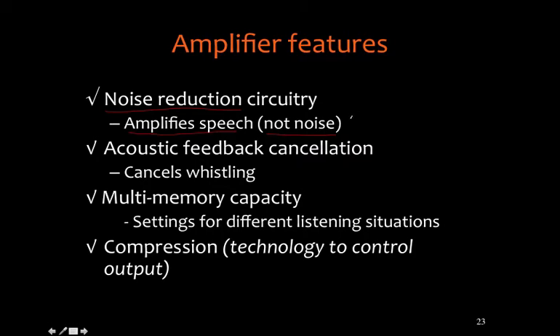Well, given a situation in which the person is listening to speech wearing their hearing aids, the problem with a hearing aid is that it's amplifying everything in the environment, including whatever background noise it may be.